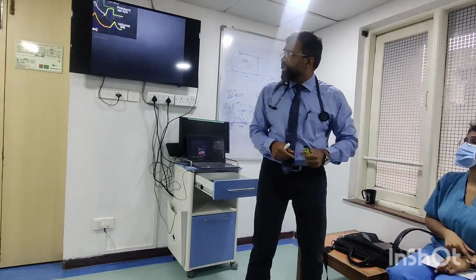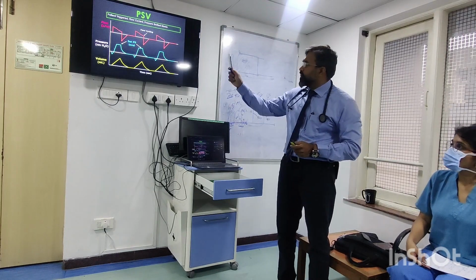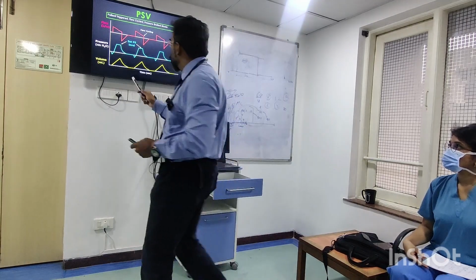So you have two breathing attempts over here, right? This is what is occurring. That's what is called flow cycling. We have a set pressure support.